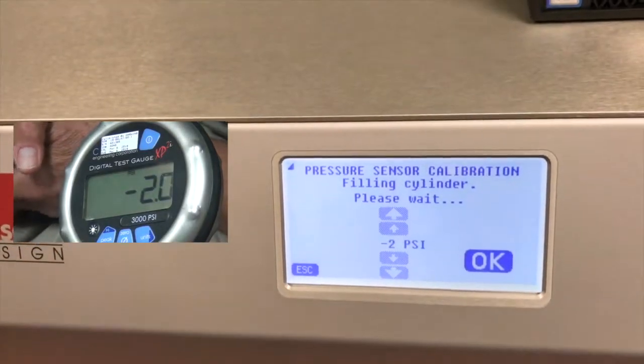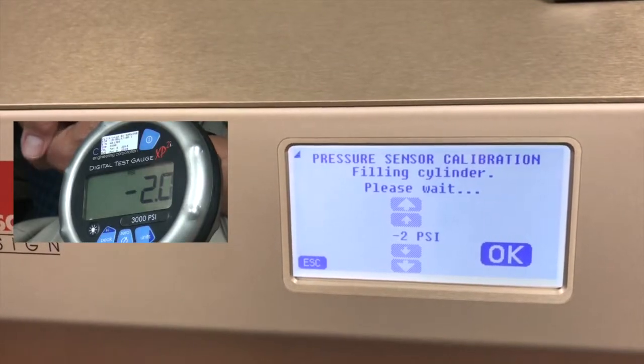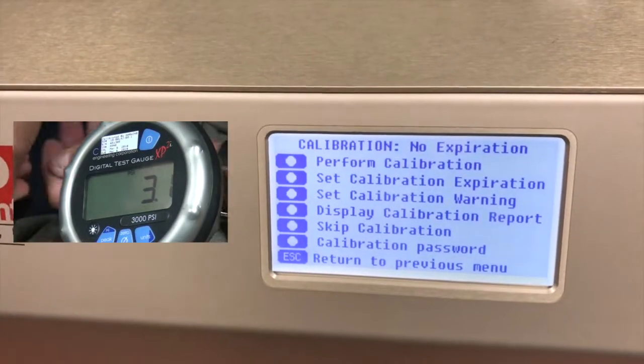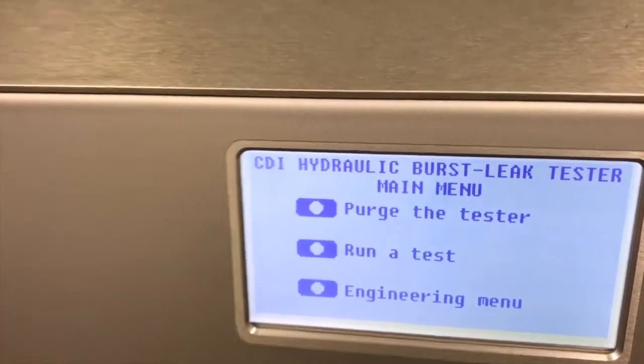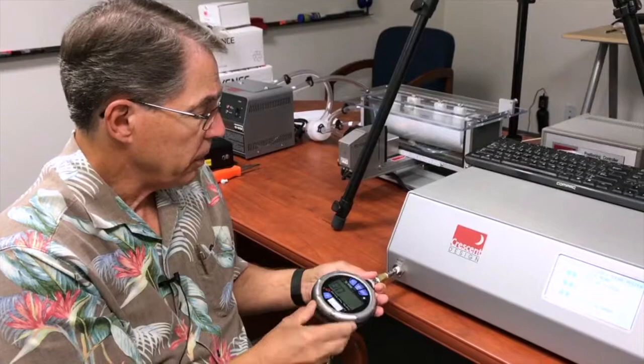The HBLT now reduces the pressure and returns to the calibration screen. We can hit escape two times and it takes us back to the main menu. I can now disconnect the gauge from the HBLT.